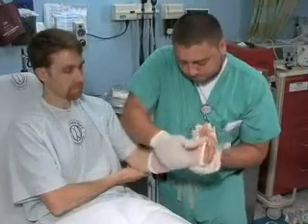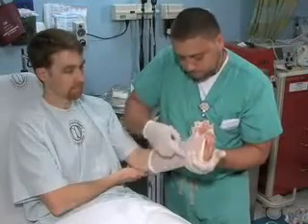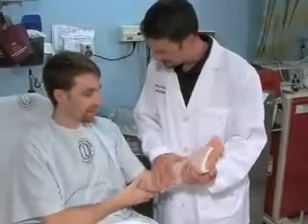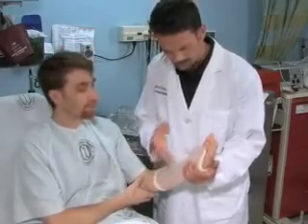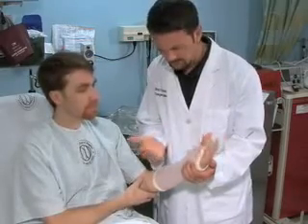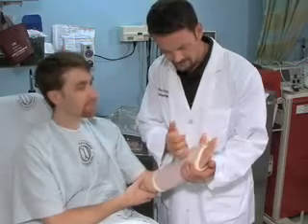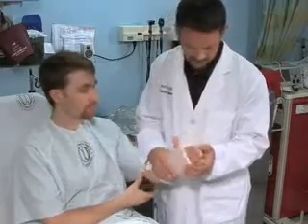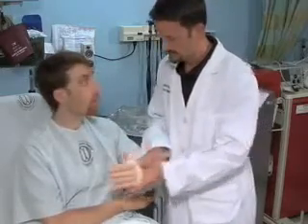Use the palms of your hands to mold the splint gently to the extremity, taking care to avoid creating indentations that might lead to pressure points. Allow the splint to dry without further manipulation or patient movement. Avoid resting the splint on a pillow during this time, as heat buildup can cause thermal injuries as the plaster dries. Once the splint has dried completely, check for adequate immobilization, strength of splint, and patient comfort.